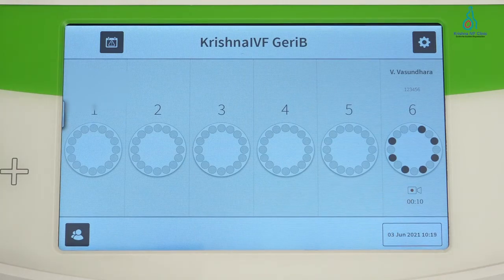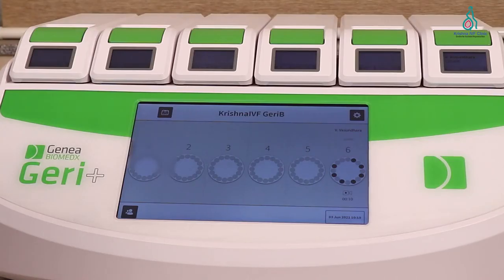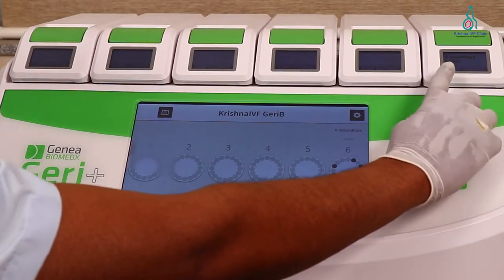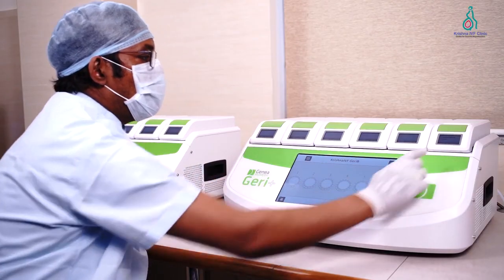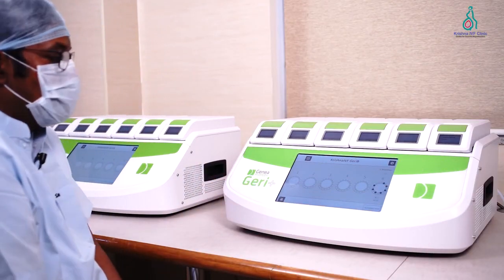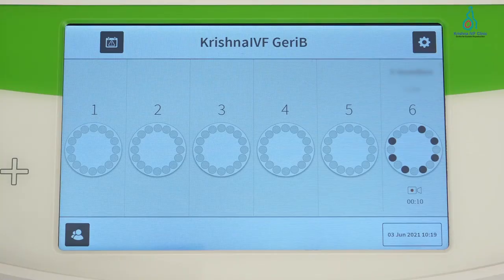Now we can see that recording has started. On chamber number 6, we are also seeing the patient details displayed. The recording of the dynamics has begun.